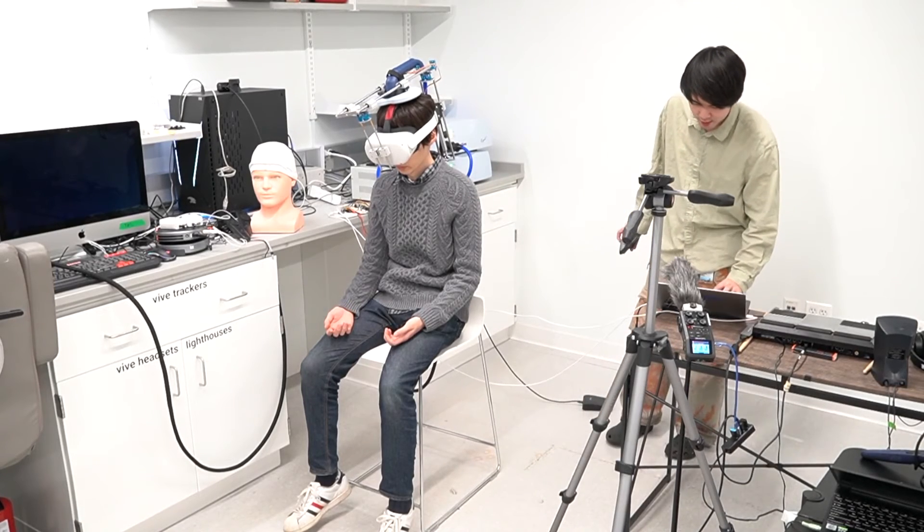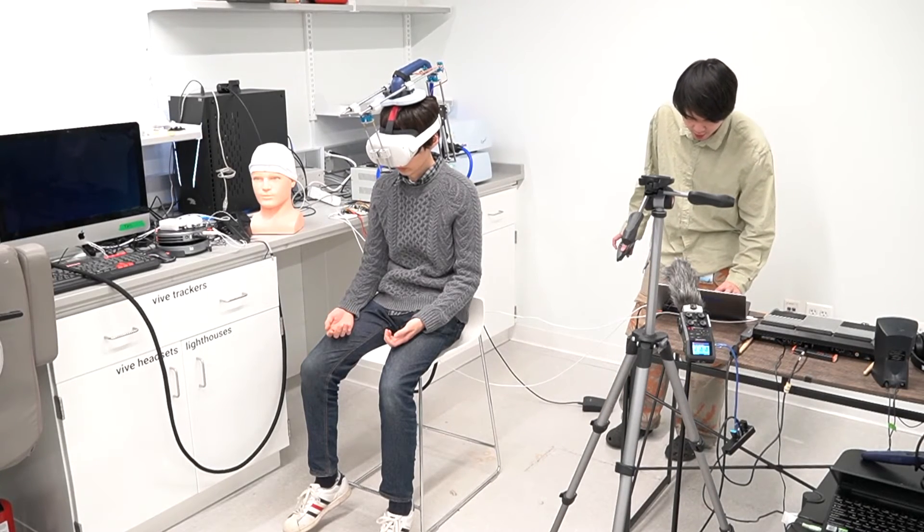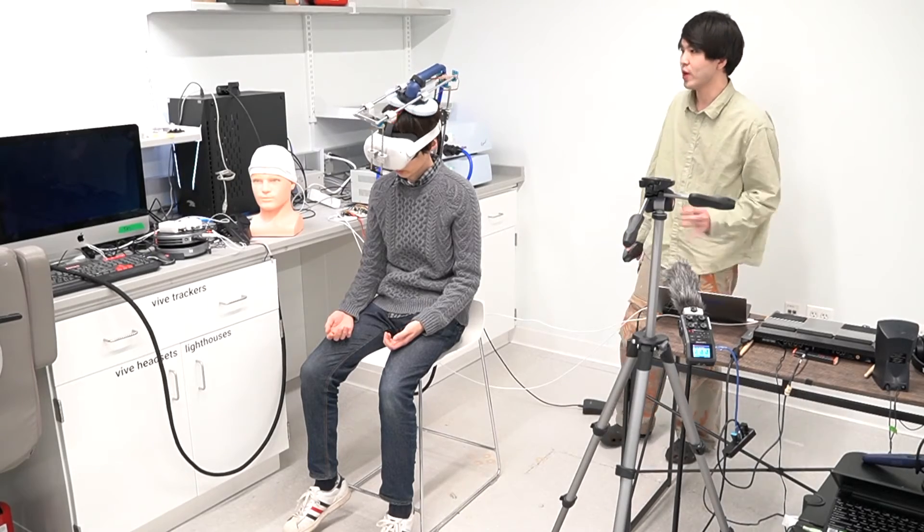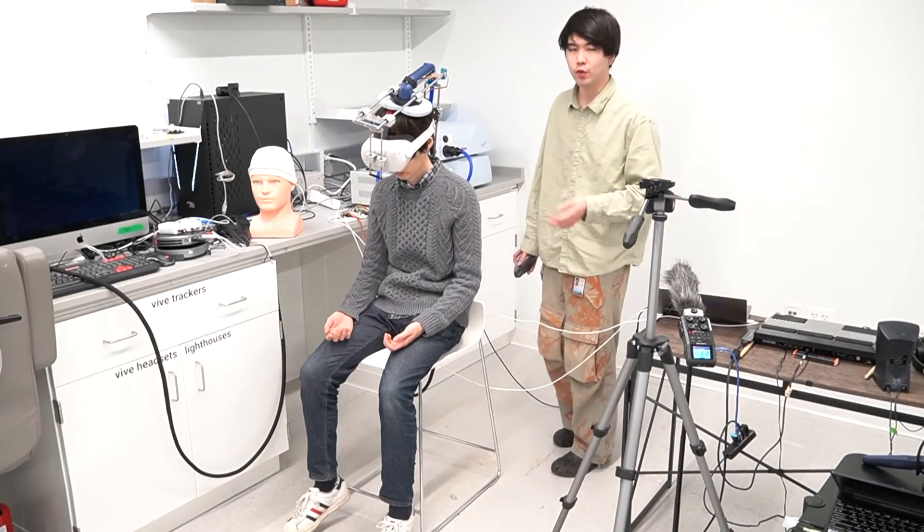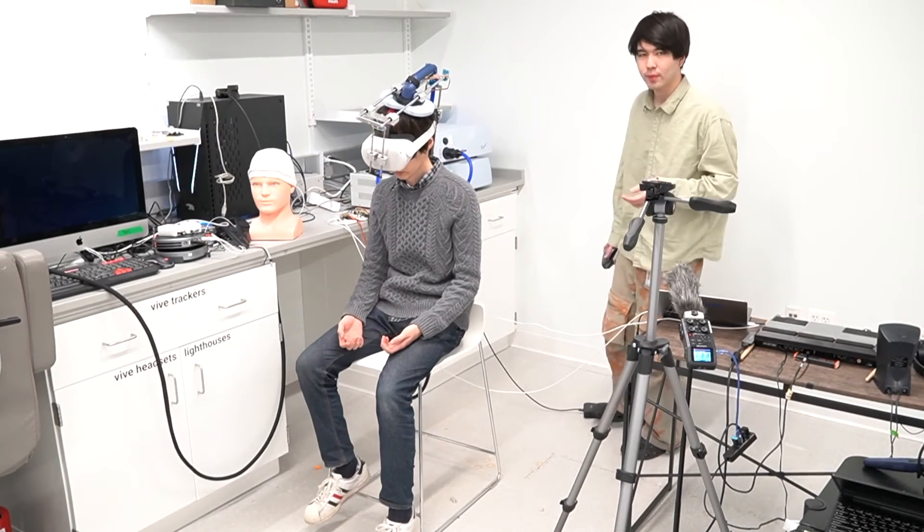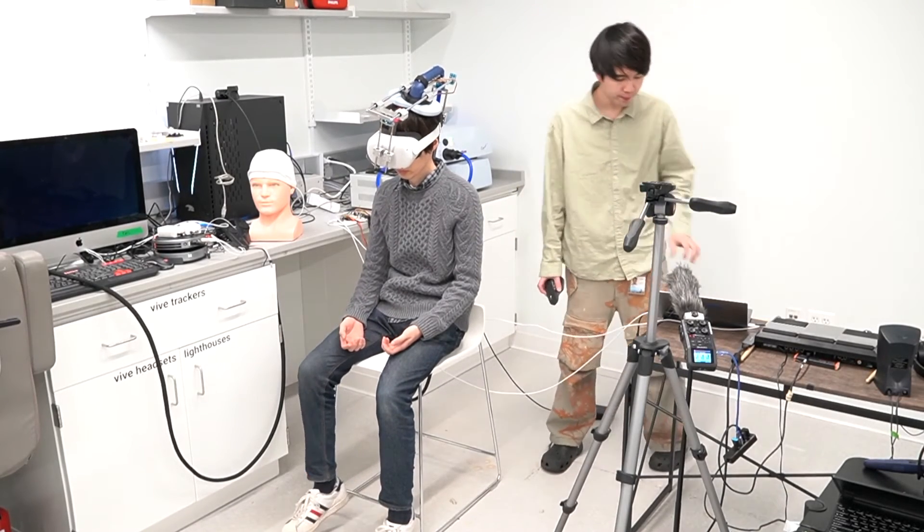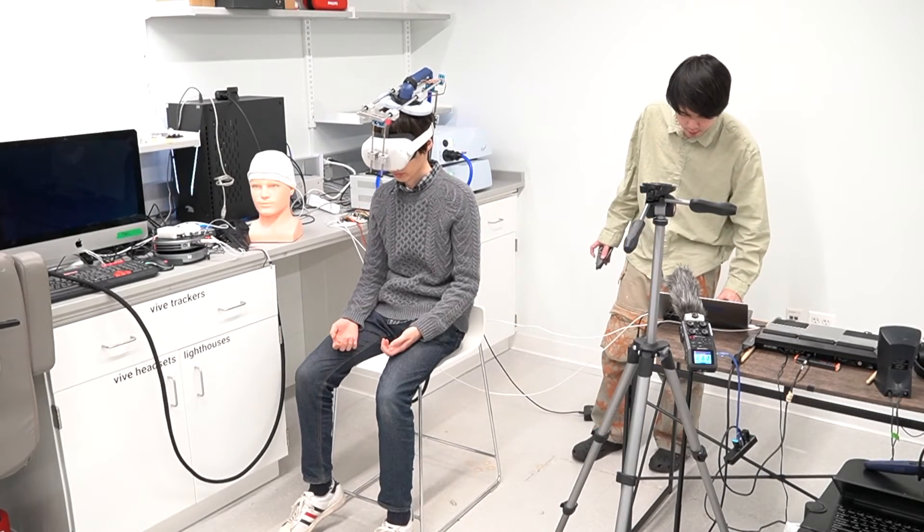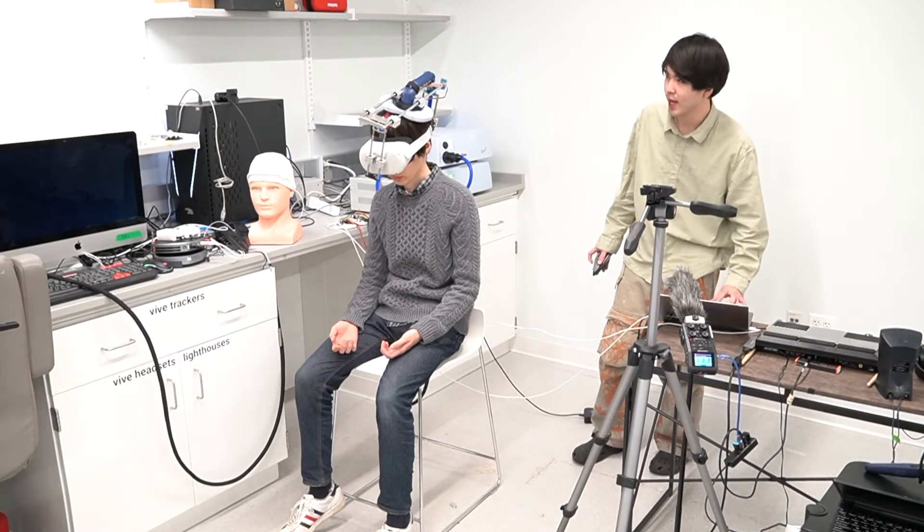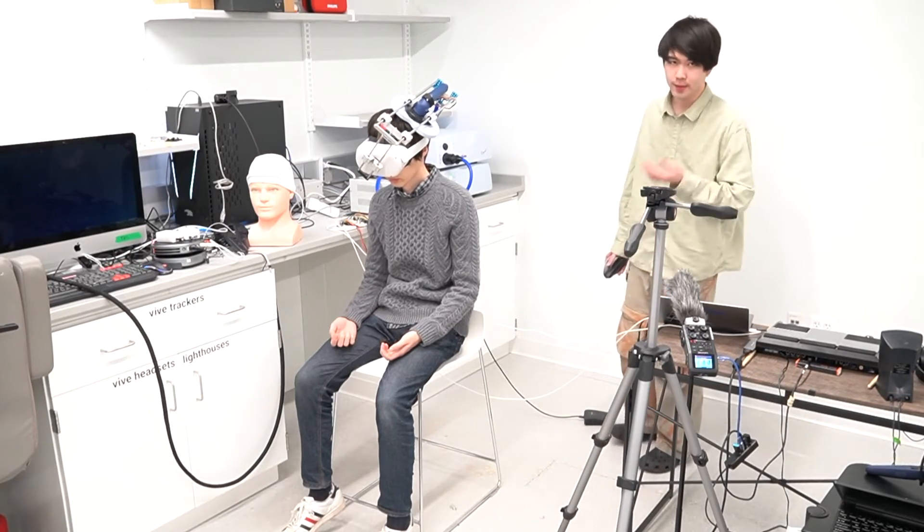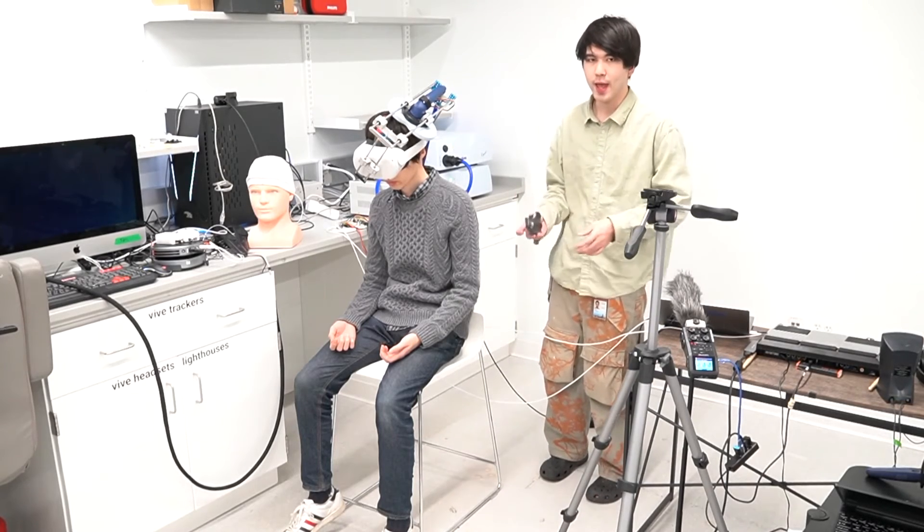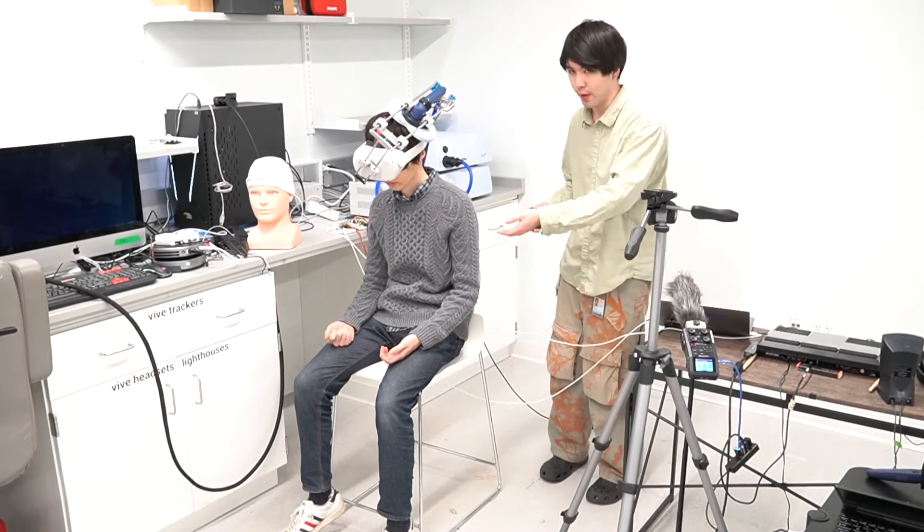Now let's switch the side. Now I move the coil to the brain region that corresponds to his right foot. And his right foot twitches. Lastly, we even move this to the area that corresponds to the right hand. And you also saw that Aki's hand moved and sensation he also felt.